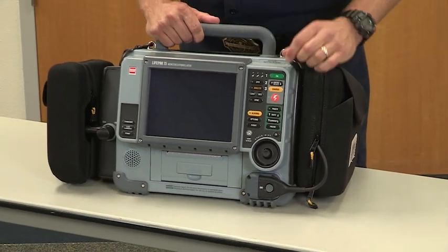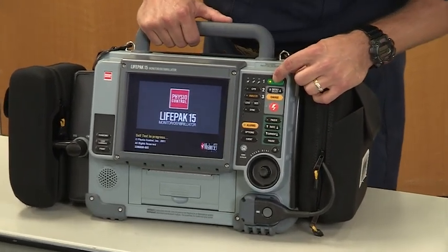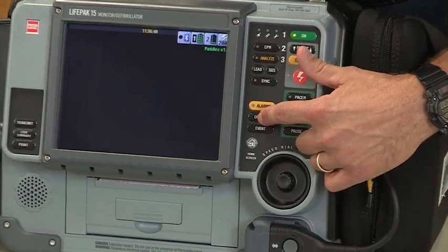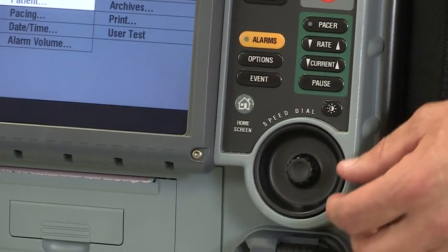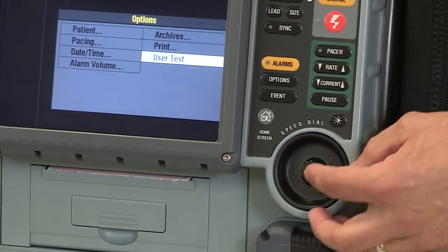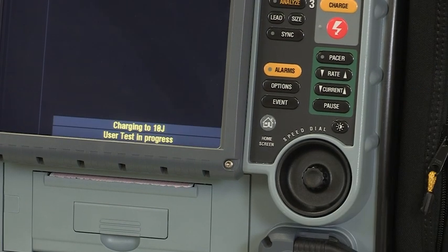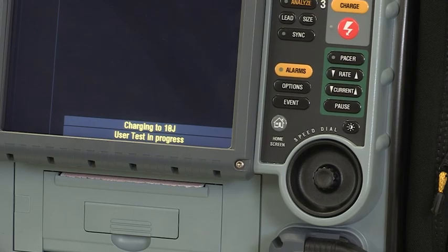Then we're going to turn on the machine. Go down to options like we currently do now in the LIFEPAK 12. Select options. We'll then use a speed dial. Operates exactly like the LIFEPAK 12. Select user test. Push the button, push the dial selector in, and wait for the user test to finish.